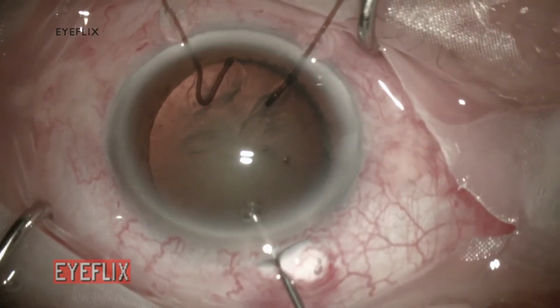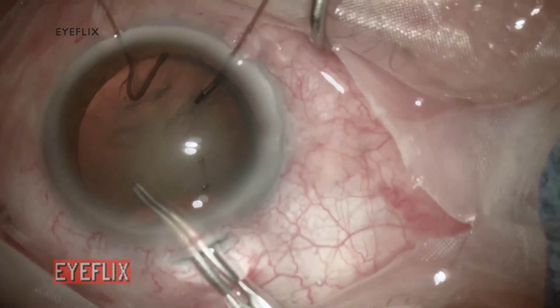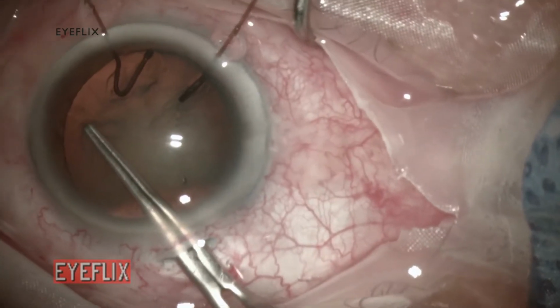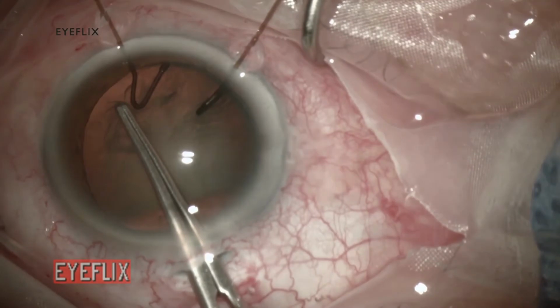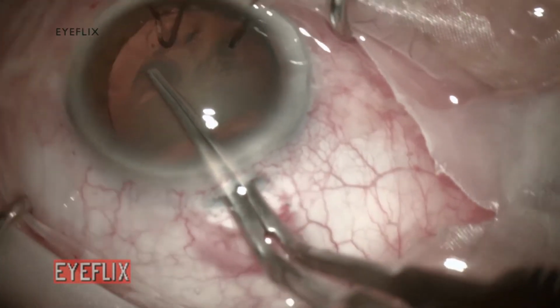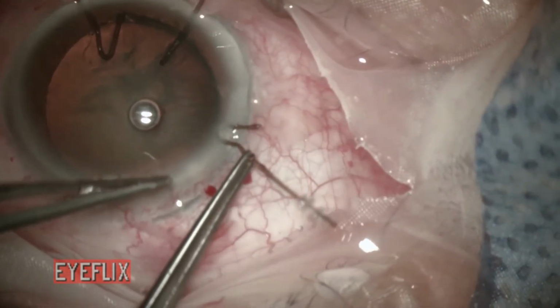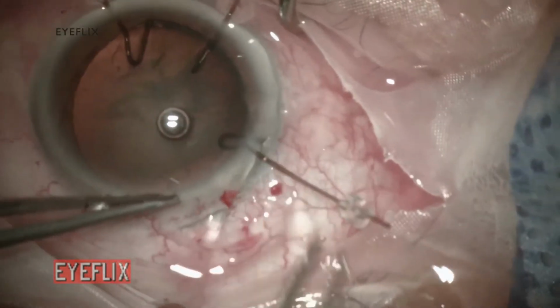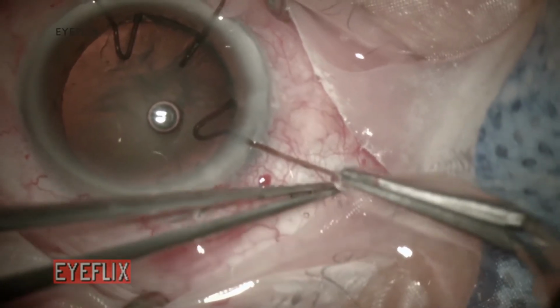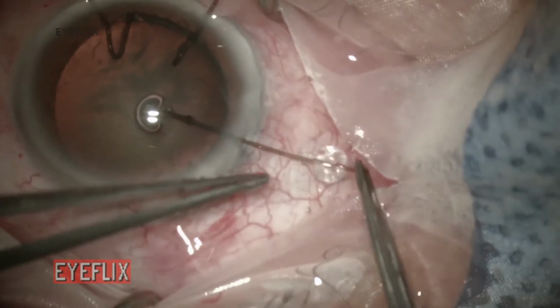Here I'm carefully completing the capsulorhexis. Now I'm inserting the final capsular retractor. You can see how we achieved a good centration of the lens and the capsulorhexis with this approach. I find the use of the retractors very helpful to avoid vitreous prolapse through the dialysis.